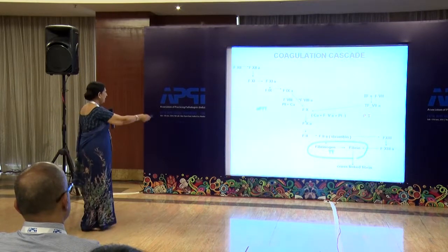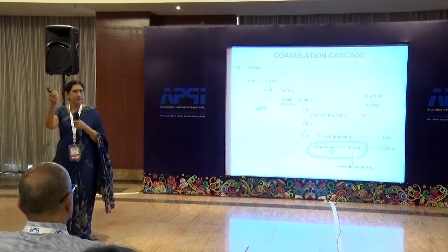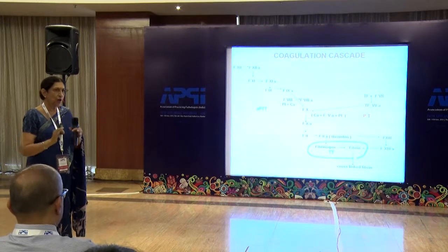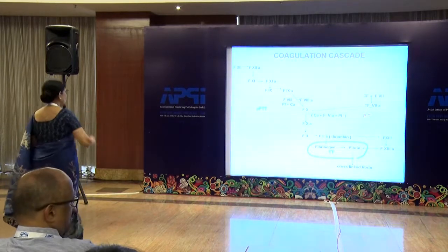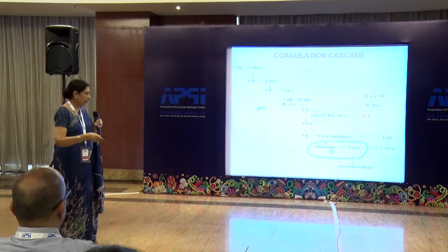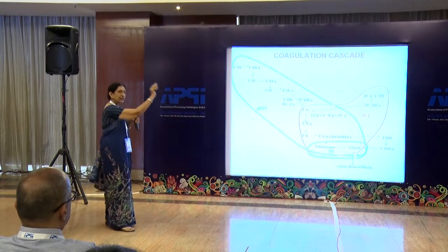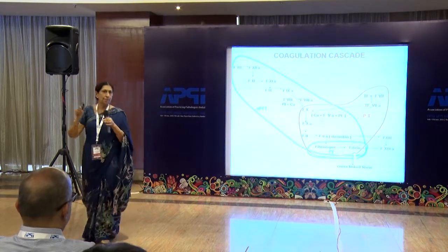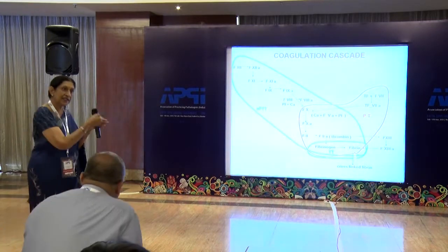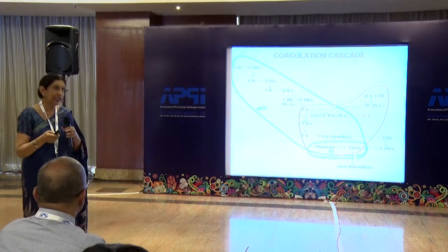It is just saying that fibrinogen is present and it clots immediately, usually from 7 to 10, 11 seconds. That means fibrinogen is normal and it has made the clot, because our endpoint for all these 3 tests is clot formation. Okay, all 3 together, but poor factor 13, nobody is bothered. All 3 tests have not even taken cognizance that there is factor 13 which bleeds. So your patient may be factor 13 deficiency.